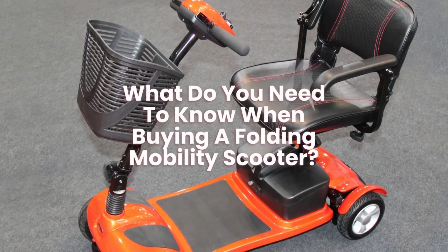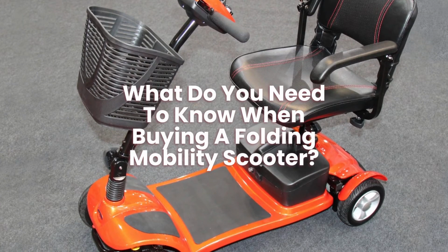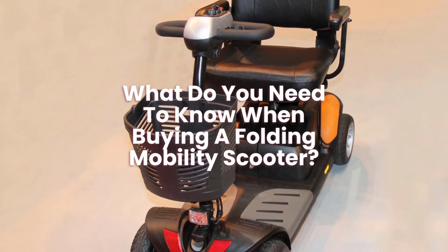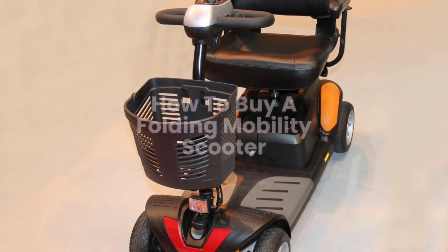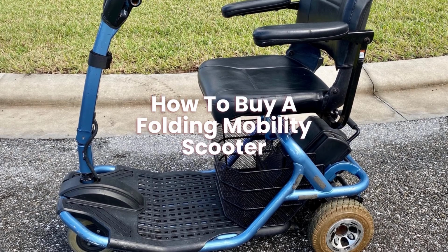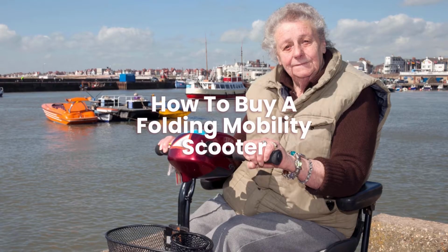What do you need to know when buying a folding mobility scooter? When buying a folding mobility scooter, you need to be aware that due to their portability, their batteries may not be as big, so you might not get as much distance as other types of mobility scooters. How to buy a folding mobility scooter? The best way to buy folding mobility scooters online is to shop around first, as there are so many different ones to pick from, so do your research first.